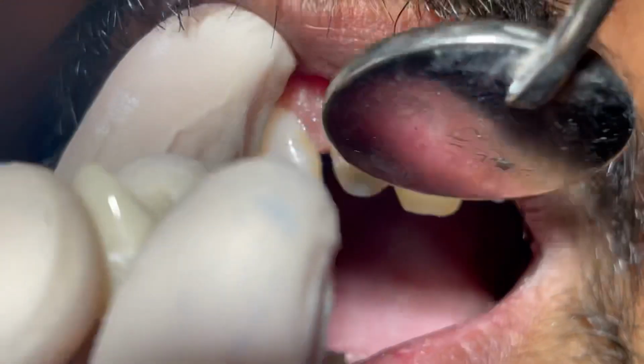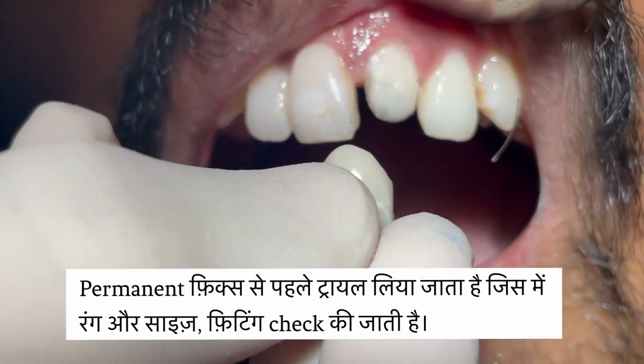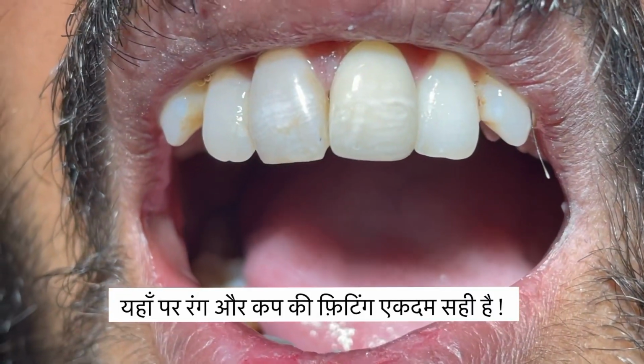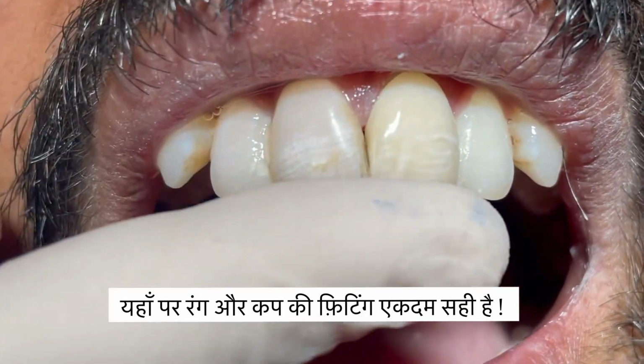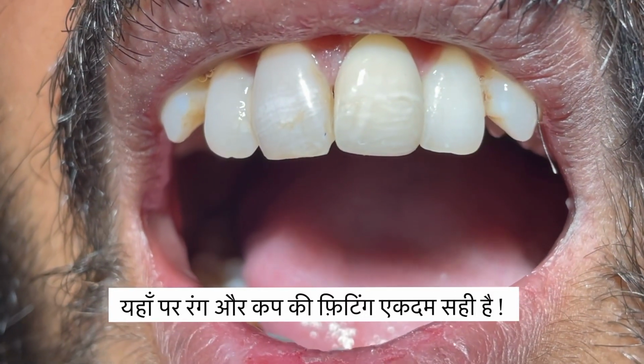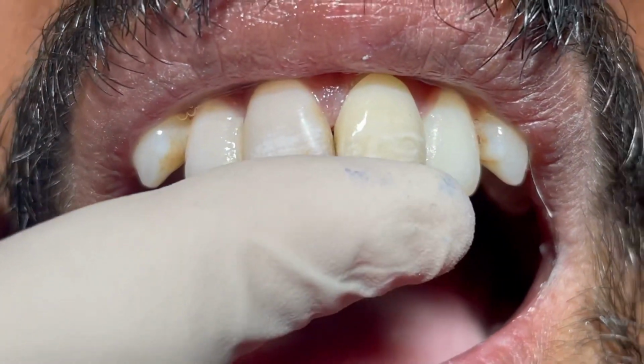Now we'll go for a trialing process where we observe the color, shape and size of the crown. And here you can see this crown is absolutely color matching and the shape and size are absolutely fine. So if our parameters look fine, then we proceed with the final fixation of the crown.